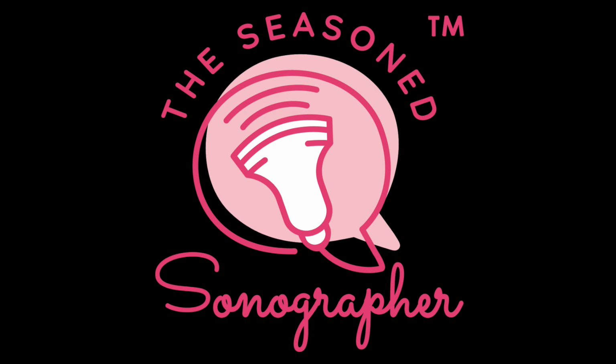Each department has its own criteria and rules, if you will, for what the sonographer can say and do. So make sure you're familiar with how much you can say to the patient without compromising any policies. The vaginal ultrasound, it's just an amazing tool. It just sets the stage for the rest of the pregnancy when you can confirm that viability and get a due date and move forward.